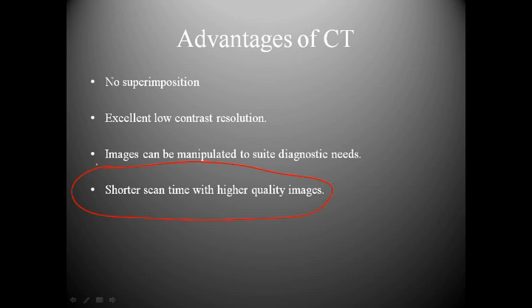The patient actually has to be inside the scanner gantry. And then to produce high quality images while doing so, those are things that CT has really met and excelled at. But also, we now have the ability to manipulate these images so that the physicians can gain better diagnostic quality and diagnostic value from them.